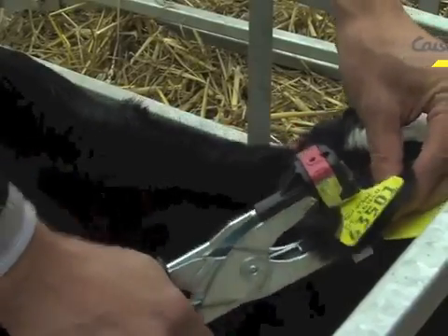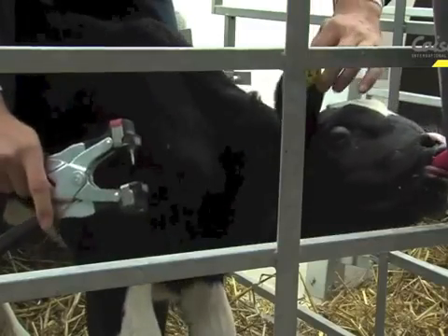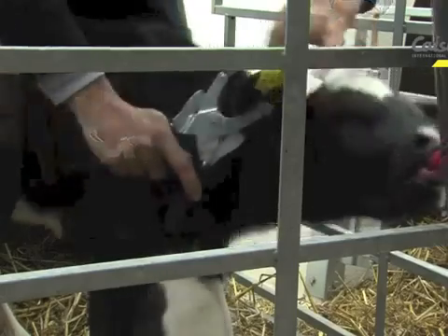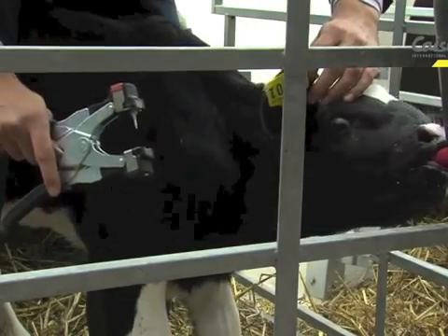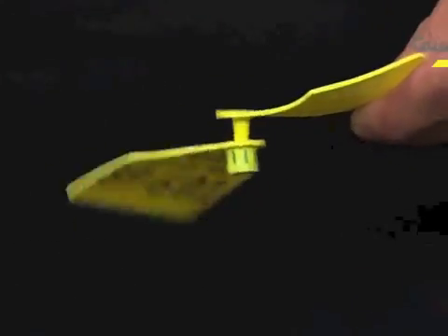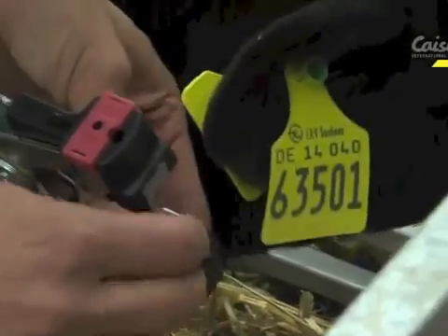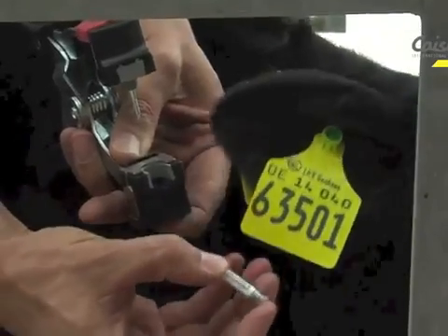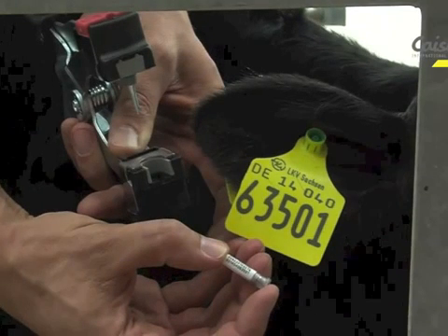Close the applicator onto the ear and on contact, close the tag with one smooth, solid contact until it hits the firm stop point. Quickly release and drop the applicator away from the ear. The sample will be left in the applicator. Push it out from the base, and it's better to do this away from slats and straw bedding in case you drop it.